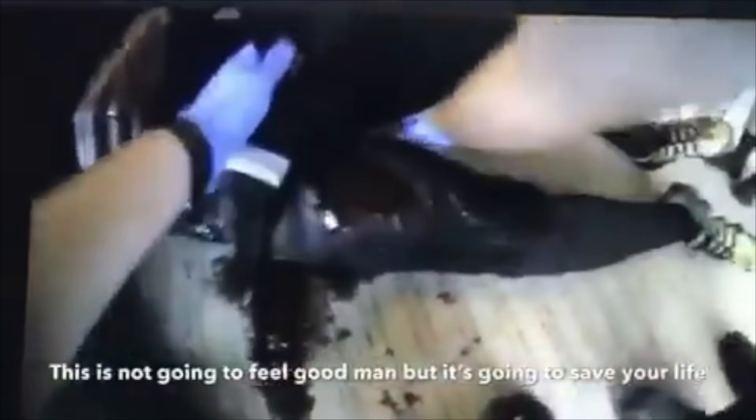The officer here chooses to apply the tourniquet over top of the clothes. Typically we do want to try to put the tourniquet on bare skin, but you may not have the time or resources to expose the wound. So you can apply the tourniquet over top of the pants. If you're going to do this, I would recommend checking the pockets for flashlights, knives, things like that. But you can absolutely put a tourniquet over top of the pants.